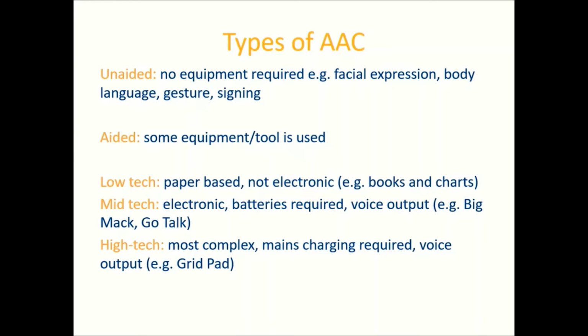And then we've got high-tech AAC. So that's really the most complex devices that require mains charging and always have voice output. For example, a grid pad. So today, of course, we're focusing on low-tech, which is basically paper-based AAC.